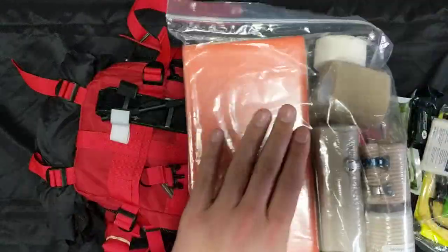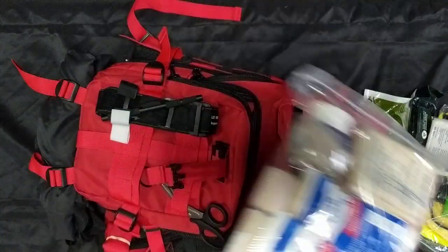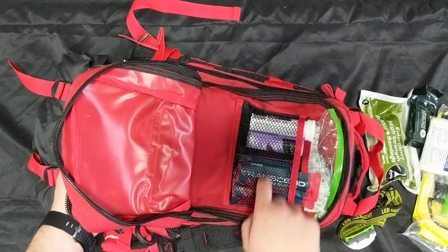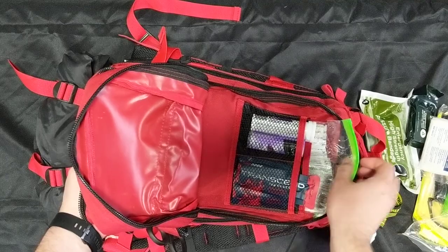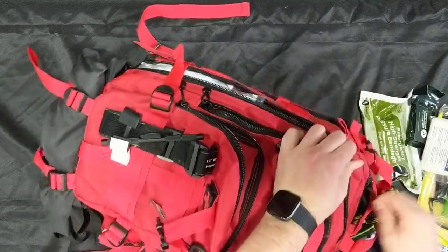Then you have your splinting kit with cold packs, triangulars, elastic wraps, Coban, athlete's tape, a moldable aluminum splint, and some tongue depressors — for all your fractures, sprains, and strains. We also have glucose gel, glucose tabs, and electrolyte tabs, plus a whole bunch of about a hundred band-aids for general use.